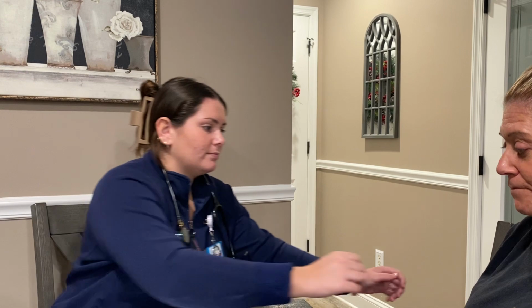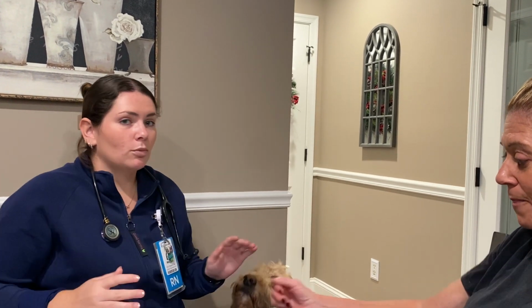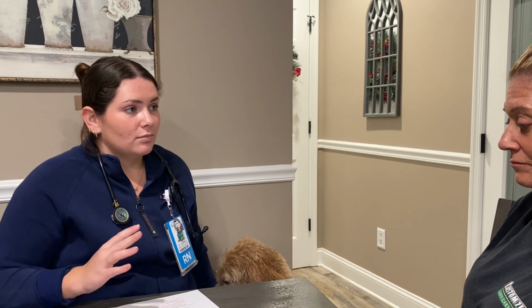So I'm going to go ahead and take your blood pressure and I will listen to it. So normal blood pressure is 120/80, okay? I would also listen to your heart rate. So normal heart rate is between 60 and 100. I also look at your pulse oximetry, which determines the oxygenation within your body. A normal SpO2 is between 90 and 100.